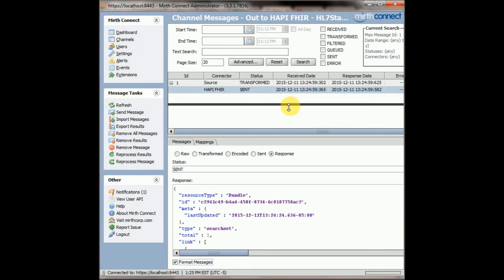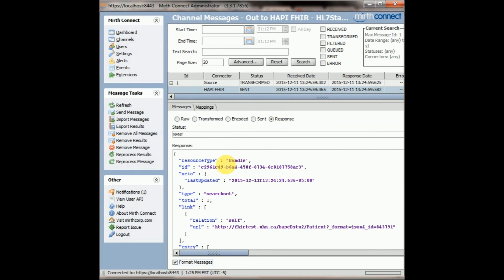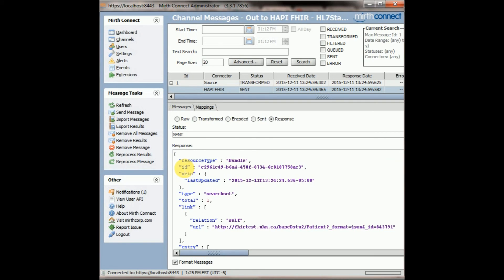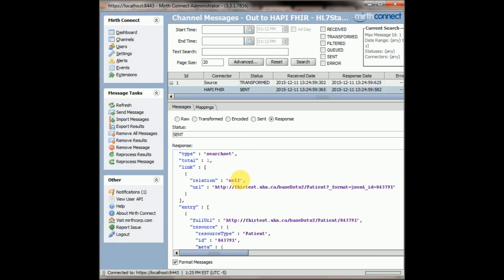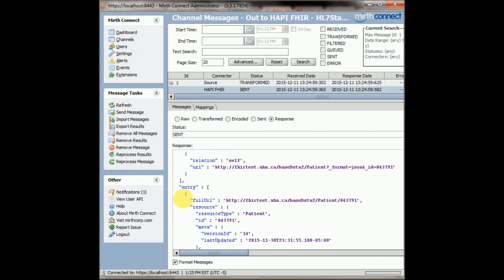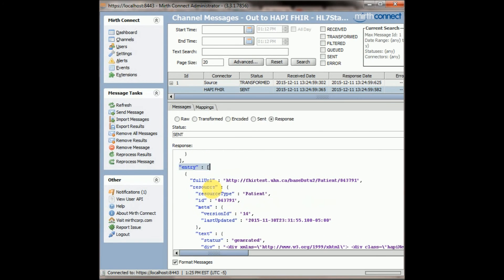Click on response, and there we go, awesome. So the way that FHIR handles it, if there's bundle meaning more than one, then it will say resource bundle, so that's okay, you can ignore that. You want to come down to the entry area, and that's where it starts to list the actual results. And you can see that the resource type is a patient, as we said.